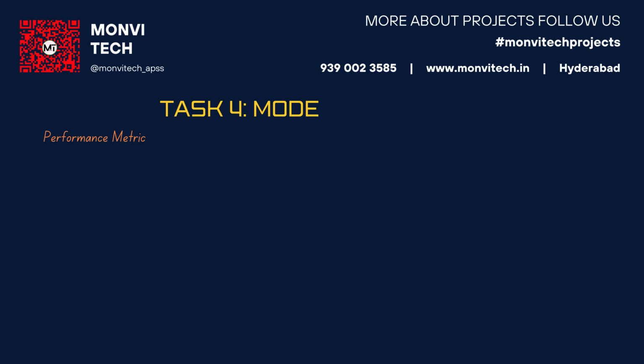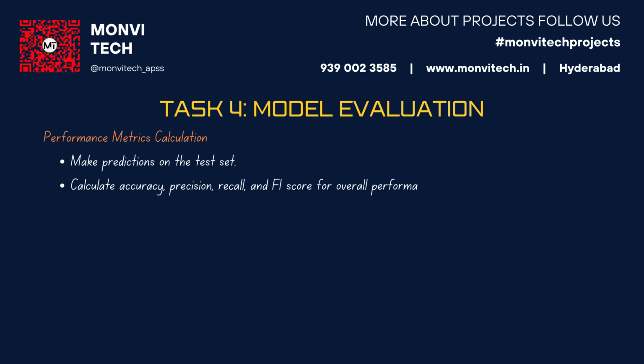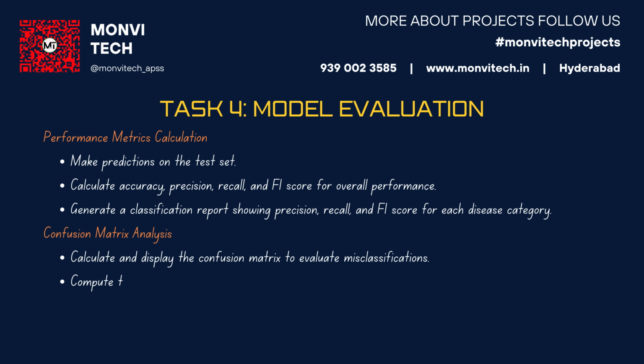Task 4. Model evaluation performance metrics. Calculation. 1. Make predictions on the test set. 2. Calculate accuracy, precision, recall, and F1 score for overall performance. 3. Generate a classification report showing precision, recall, and F1 score for each disease category. Confusion matrix. Analysis. 1. Calculate and display the confusion matrix to evaluate misclassifications. 2. Compute the accuracy per class from the confusion matrix.